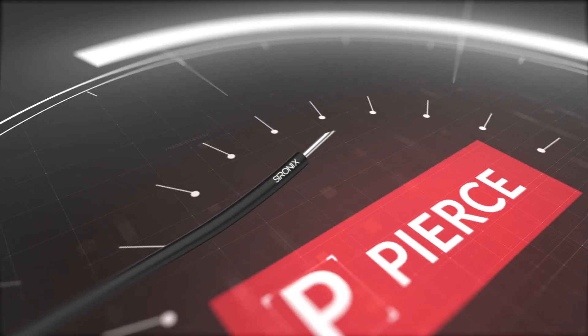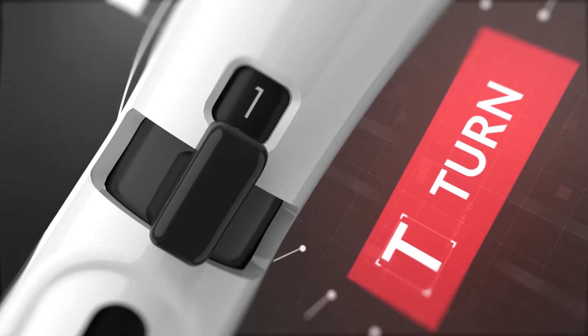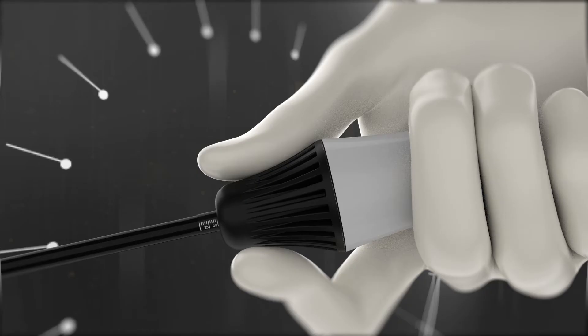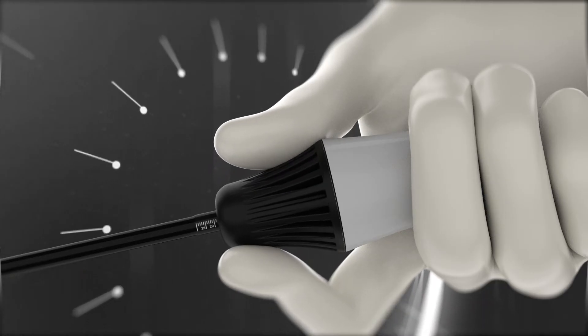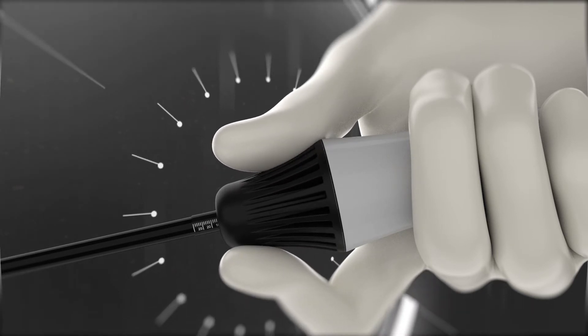Can deploy in three simple steps. Pierce, turn, and fire. Adjust the needle's depth by rotating the depth control knob, depending on the meniscus thickness.